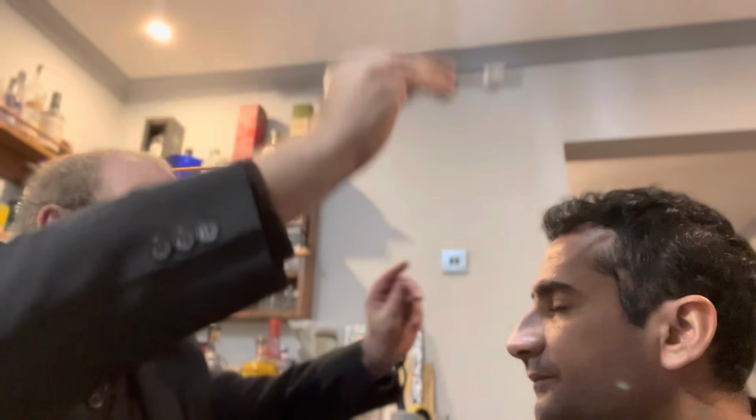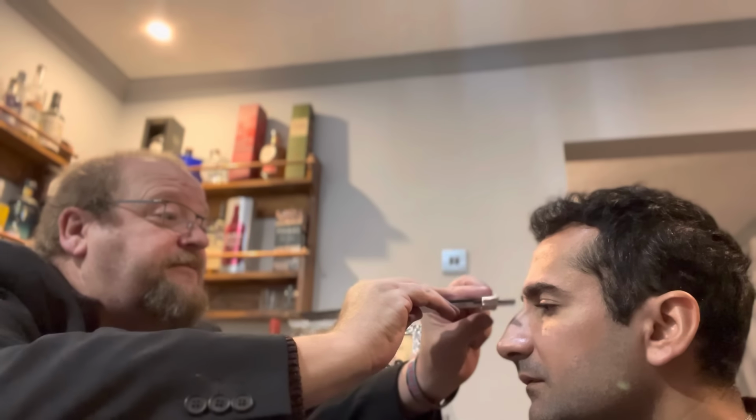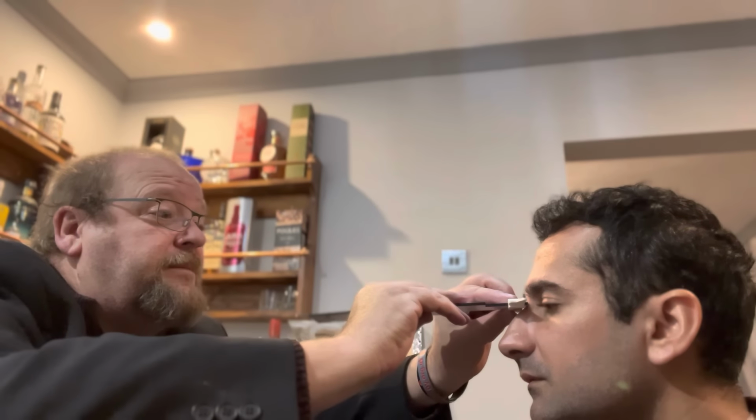Right, so now I'm going to measure your crest projection. Your bridge projection is measuring where basically your eyelashes come to against the bridge of your nose. If you just tip your head to the side for me, I can see your eyelashes are quite long, and they actually project further than your nose. So I'm expecting a negative crest projection. What I do now is put this onto your nose, and tilt it down about 10 degrees, which is the effect of a frame in the pantoscopic tilt.